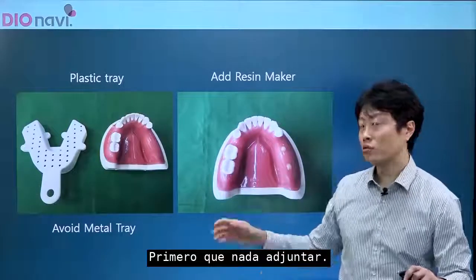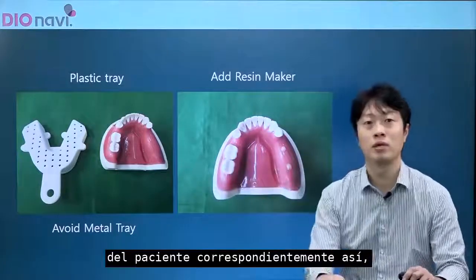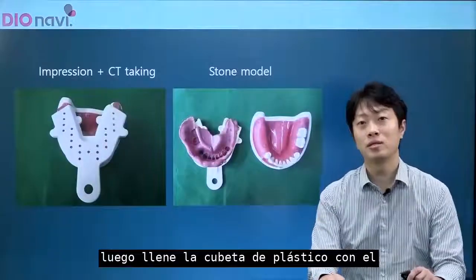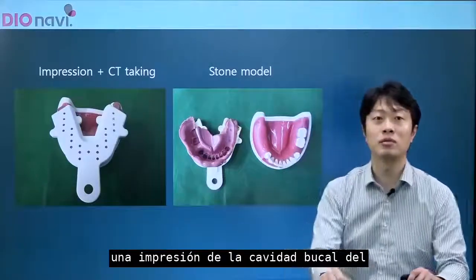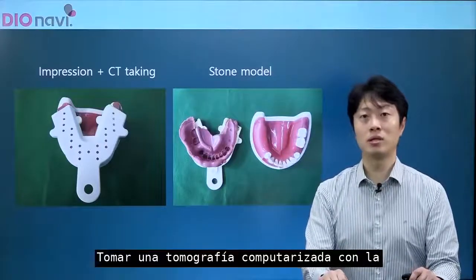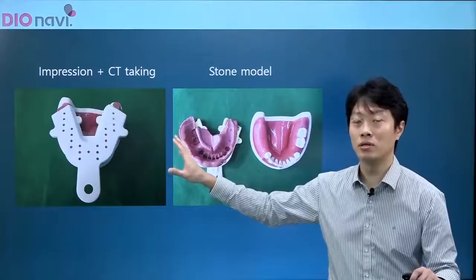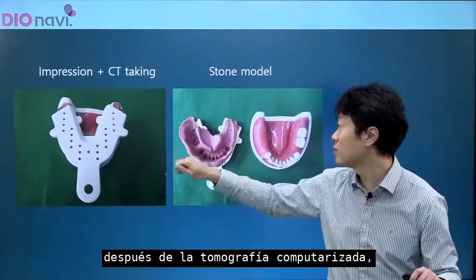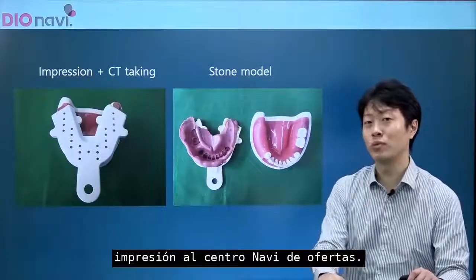First of all, attach the resin markers to the patient's oral cavity correspondingly, like this. Then fill the plastic tray with the rubber impression material and acquire an impression from the patient's oral cavity. Take a CT scan with the tray placed inside the oral cavity. After the CT scan, take the tray out and send the impression material to the DIOnavi center.